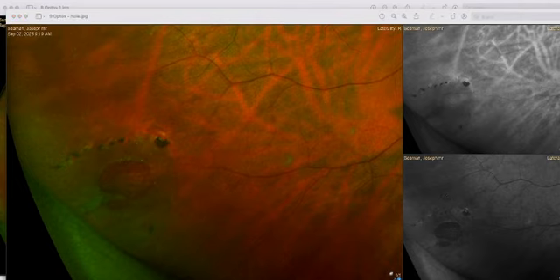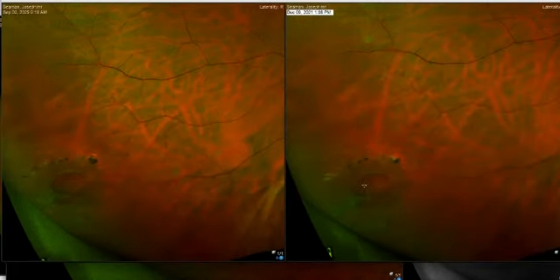And most importantly with all of this technology is monitoring. So this shows a comparison, looking on this side at 2021 and comparing through to my test last week. Luckily for me, you can see it doesn't look any worse.